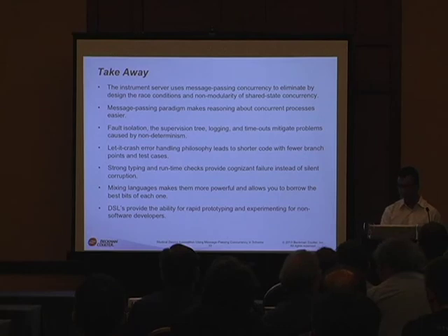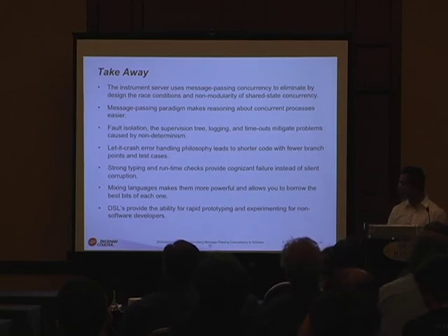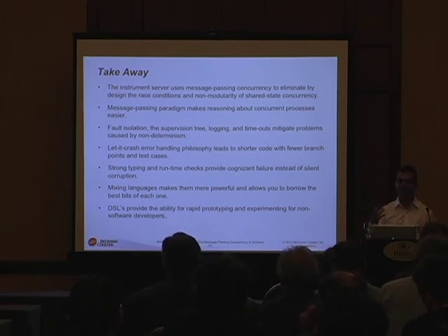And lastly, mixing of languages is really useful. We really like the syntactic abstraction of Scheme and the arbitrary precision, but we also wanted to use the message passing of Erlang and the OTP framework. So we said, make the best of both worlds, and it's really nice to be able to use the good parts of all languages rather than having to choose between one or the other. And DSLs not only make it easier for non-software engineers to use the device, but also help with rapid prototyping for software engineers as well.